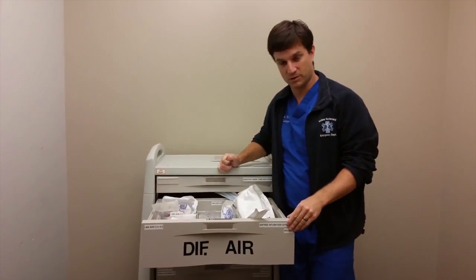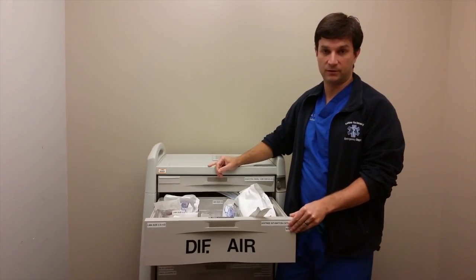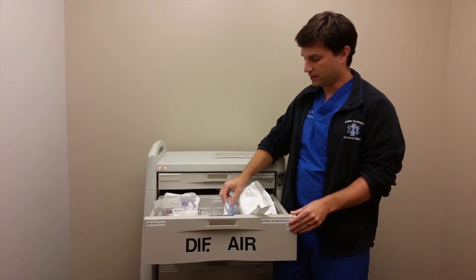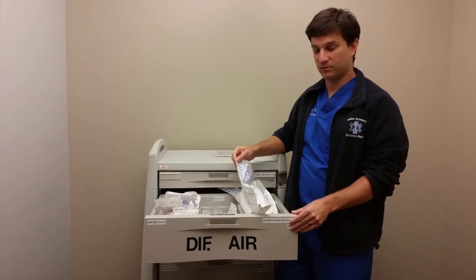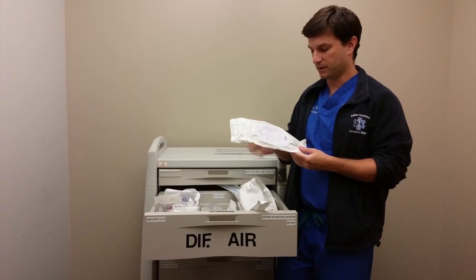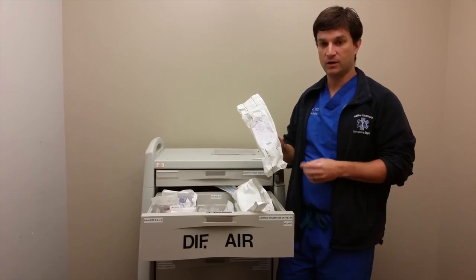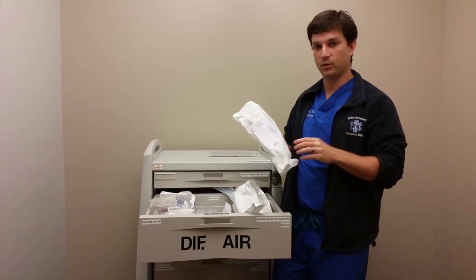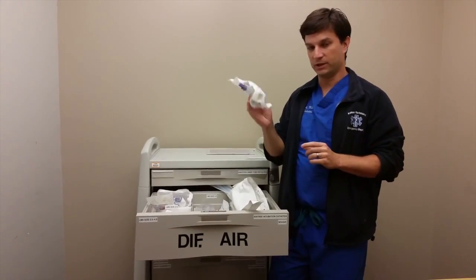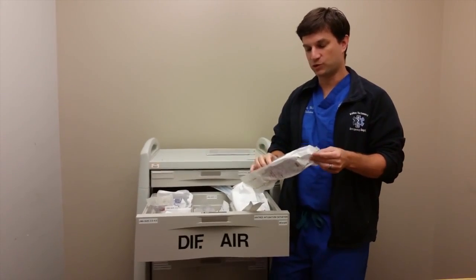So you've got a paralyzed patient that you can't get a tube into, and perhaps you can't even bag mask ventilate. And that's where the next drawer comes into place, where you have a can't intubate, can't ventilate with a bag mask valve. The next step in your armamentarium should be an LMA. And what an LMA does is it kind of bypasses the usual barriers to ventilation there, being large tongues, redundant airway, just physical blockage of the airway by putting an actual buttress in, slides along the tongue, gets into the hypopharynx. Everyone should be trained in how to do these.